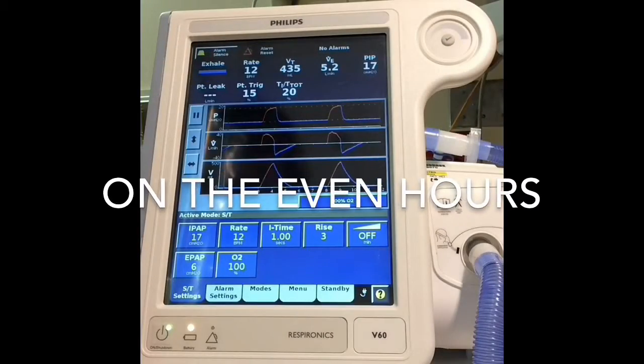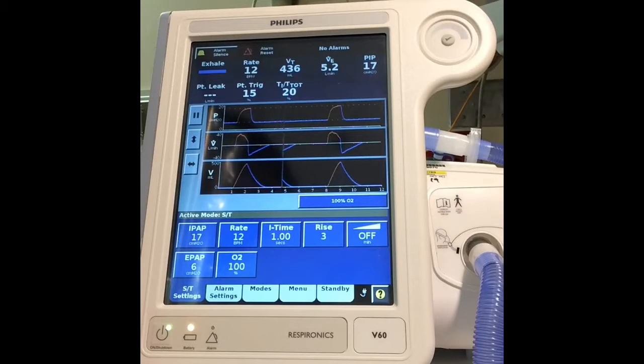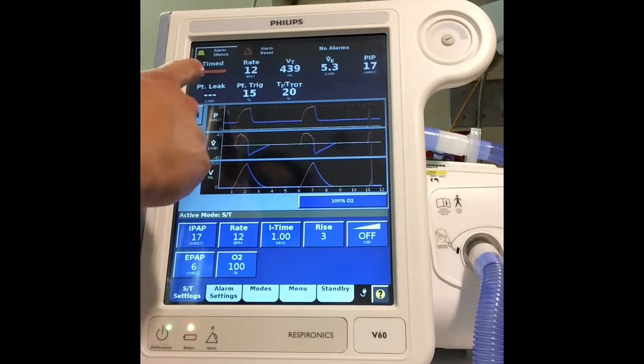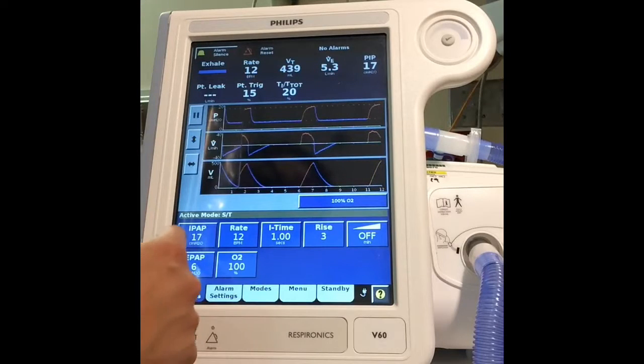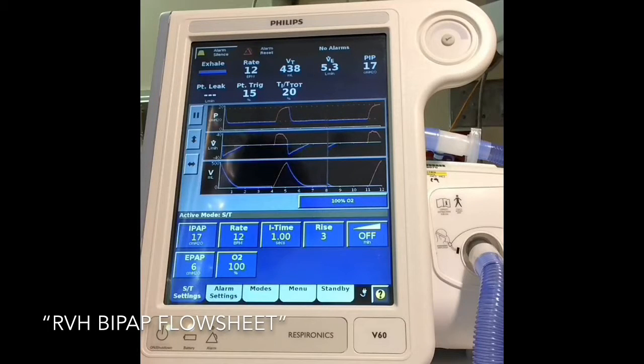Now make sure that you chart the BiPAP every 2 hours. Also, if you make a change on the BiPAP, make sure you're charting that change as well. Every 2 hours you want to do a complete assessment of the BiPAP, where you're getting all your readings out here and all of your settings down here. The flow sheet is called RVH BIPAP flow sheet.